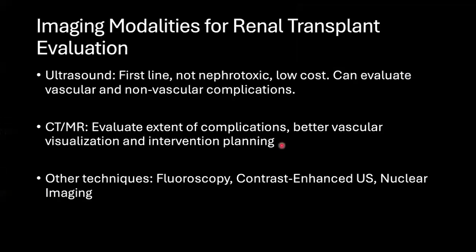We'll go over the role of each imaging modality, but basically ultrasound is our workhorse for most transplant kidneys. It's the first line. It's not nephrotoxic. We don't usually use contrast. It's low cost. It can evaluate both vascular and non-vascular complications.